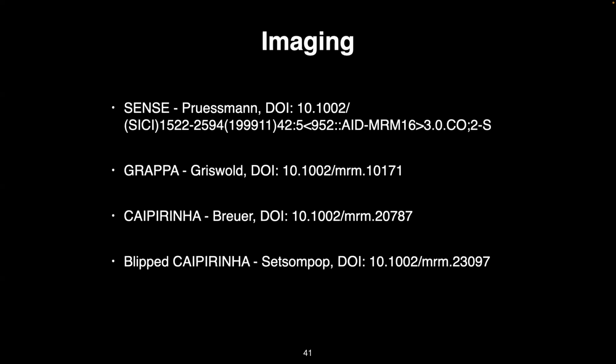I think it's worth pointing out that the effects of the gradients being switched are enough to trigger nerves so you feel something, but not sufficient to, for example, cause cardiac arrest. The important thing is that as soon as the scan stops, the sensation goes away. It can be uncomfortable, but if you turn it off, there's no harm there. So it's not going to stop someone's heart. Yeah. That's good to know.